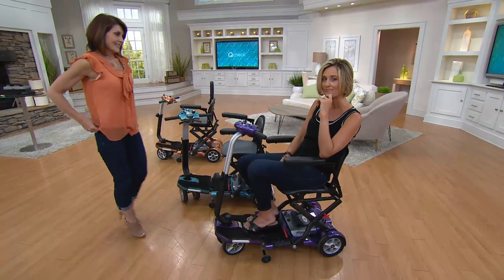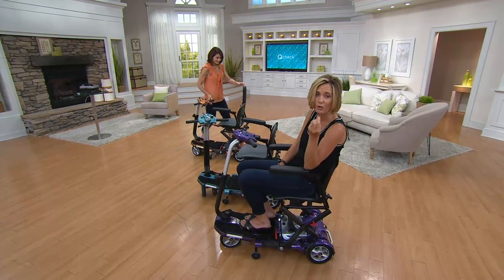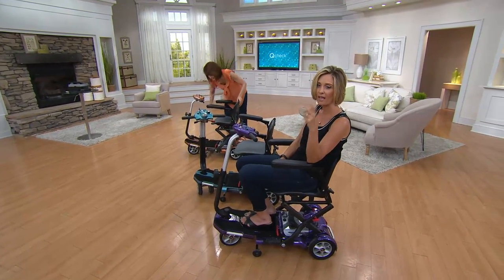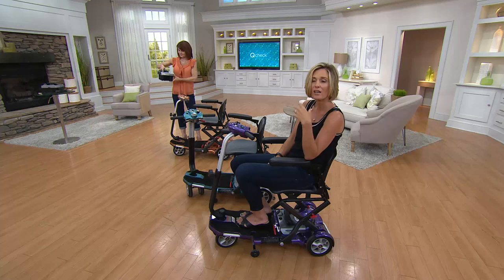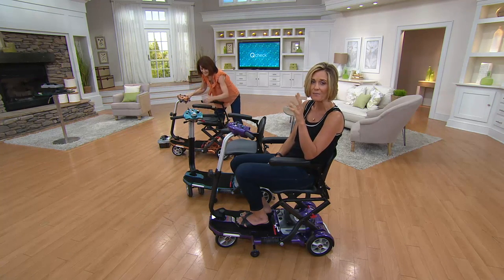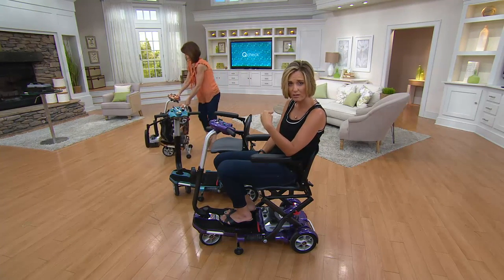Maybe it's your dad, your grandfather, your uncle, or maybe it's you who needs to spend more time with the family and get out of the house. My aunt always tells us she doesn't come to visit as much anymore because she does have mobility issues — she says 'just go without me, I don't want to be a burden.' I know that hurts her heart, but it hurts my heart even more because all I want to do is spend time with her.